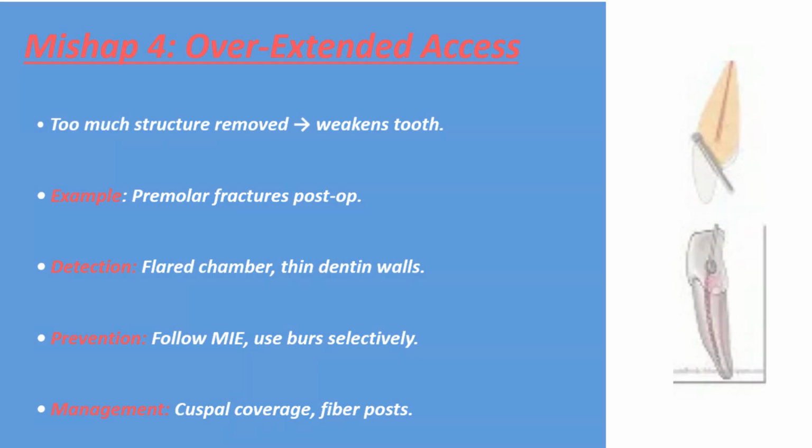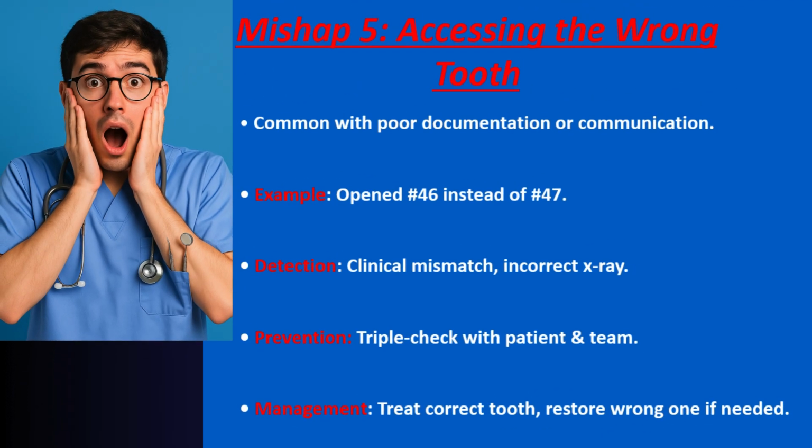Reinforce with fiber posts if needed. 5. Accessing the wrong tooth. Explanation: yes, it happens, especially with poor documentation or referred cases. Example: tooth 46 opened instead of 47.